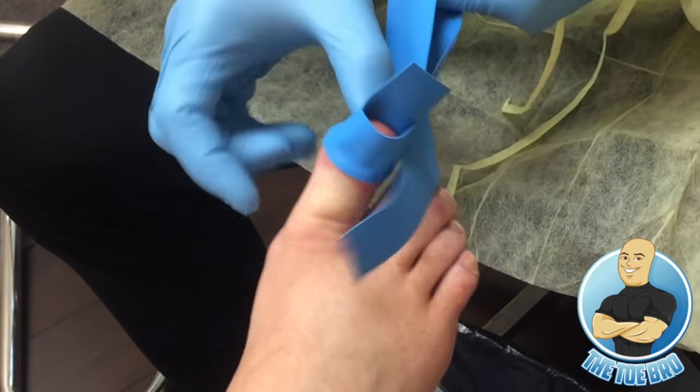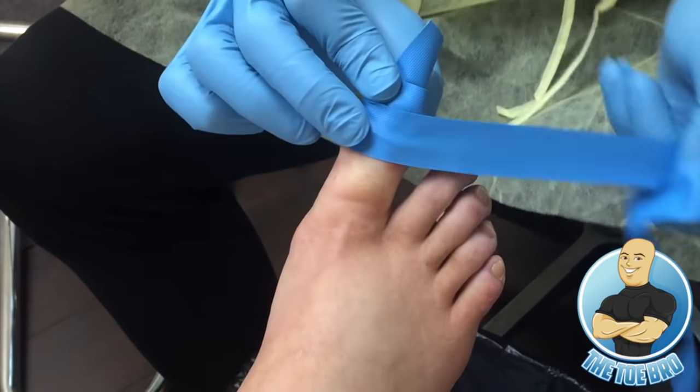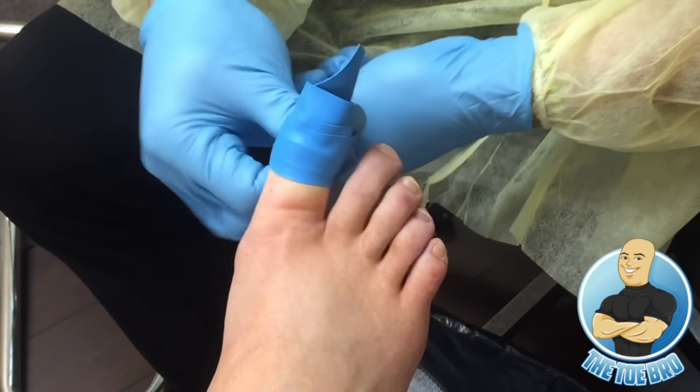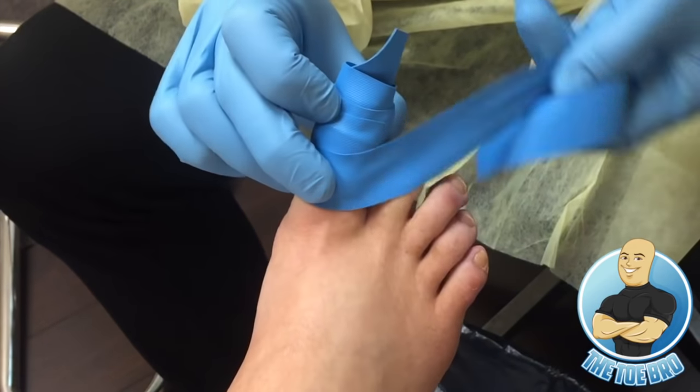So as you can see from her experience, it wasn't that bad. She made it. She wasn't in a lot of pain. People think the injection is a lot worse than it actually is. We use a very small, thin needle, and we're very slow and careful, and this actually makes the injection a lot less painful. So right now I'm putting on a tourniquet.